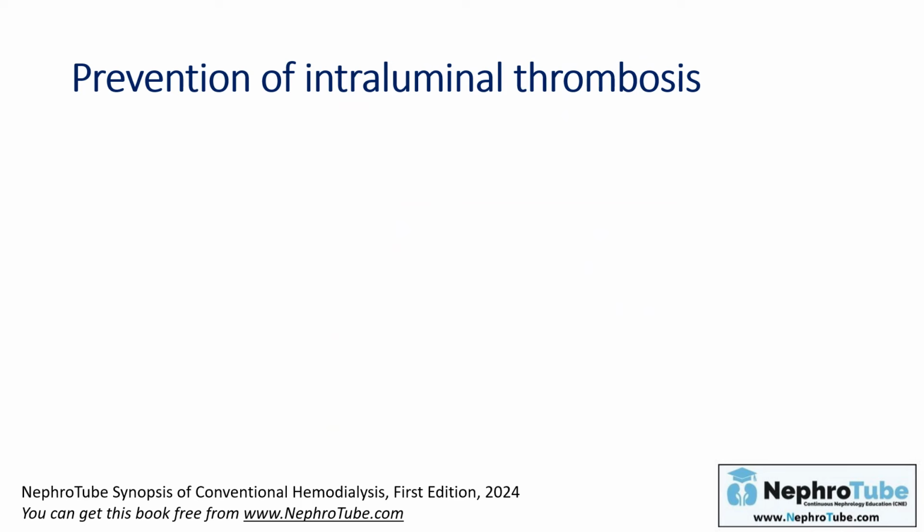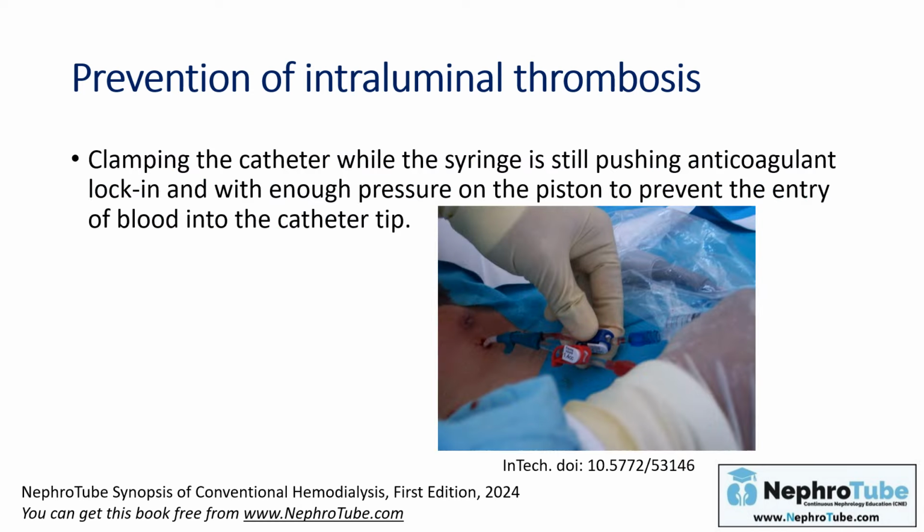So how to prevent the occurrence of intraluminal thrombosis? First, it is very common to have clots at the tip of the catheter. If I draw the catheter here, this is the continuation of the catheter inside the patient's vascular system.